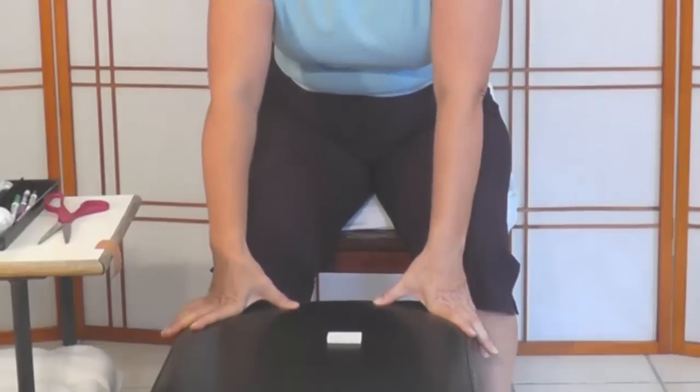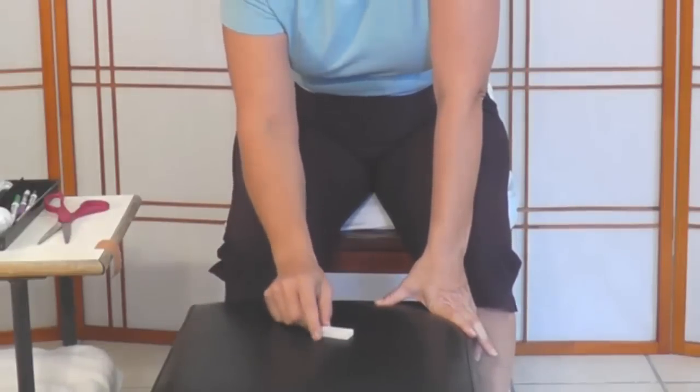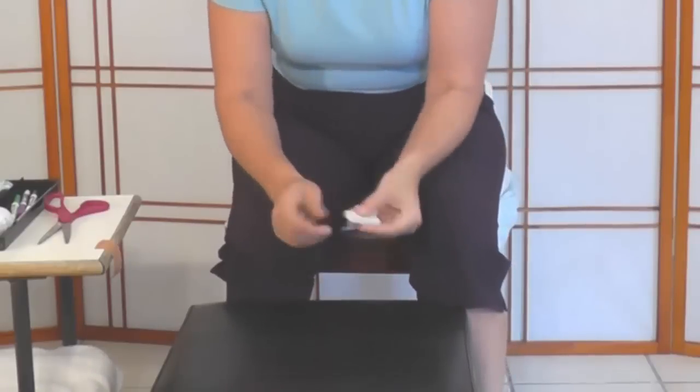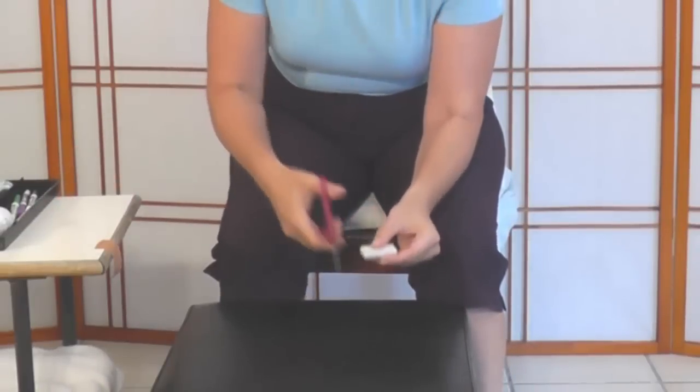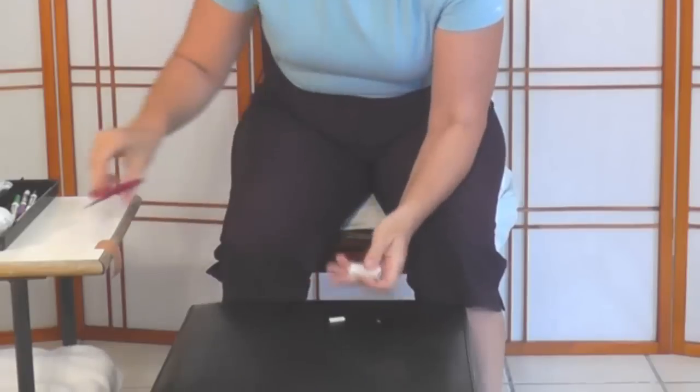Rather than ordering a special toe spacer online, the simplest solution is an eraser — a regular pencil eraser. I took this out of an art kit. It's a pretty good size, but what's nice about erasers is that you can cut them. I just trimmed the edge off with my scissors, and you can customize the length and width to suit the size of your toe.